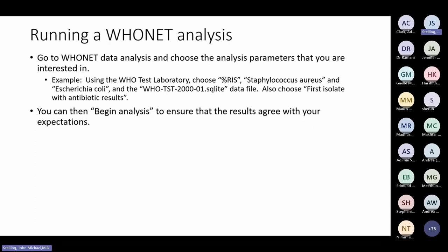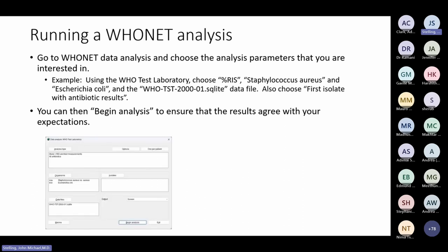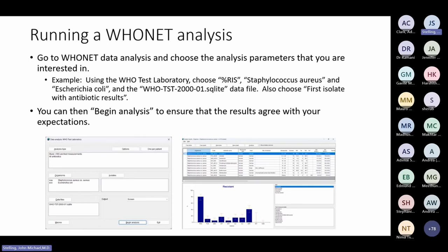The first slide here is how do I run a Hoonet analysis — not yet about macros, just how to simply run one. You start Hoonet, go to the data analysis routine, choose the analysis features you want, and then begin your analysis. As an example, I will choose the WHO test laboratory, choose the analysis percent RIS for Staph aureus and E. coli, choose the one month of sample data distributed with Hoonet from January 2000, and choose the feature 'first isolate with antibiotic results'. After clicking begin analysis, you will see the results.